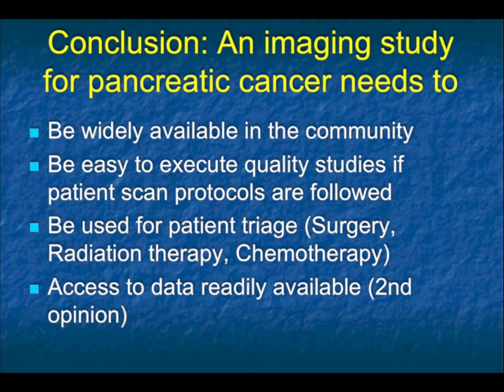Also, because CT can be transported around easily, it's easy to get second opinions. Experts do a lot better than novices, so that becomes very helpful. So with that, I've had a 3-part look at the patient's pancreas and pancreatic cancer. I've talked about what we're looking for, what some of the pitfalls are, the kind of things we need to understand, and how we need to get better. And with that, have a great day.